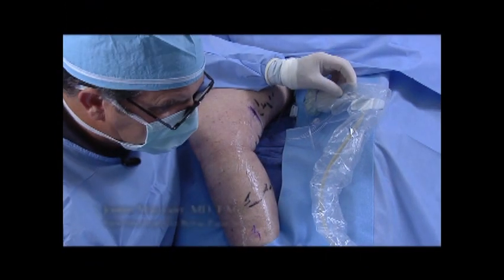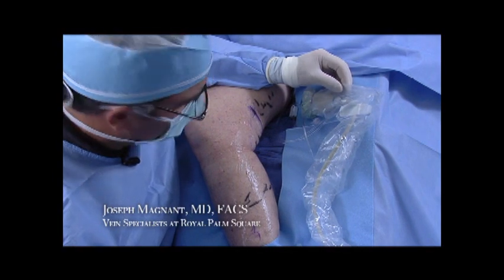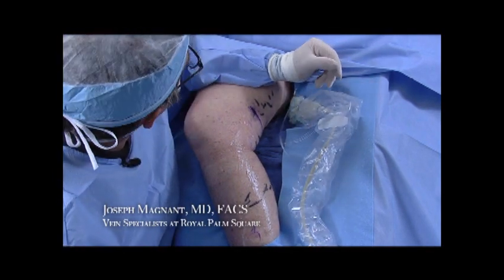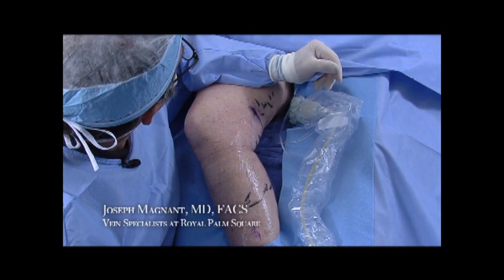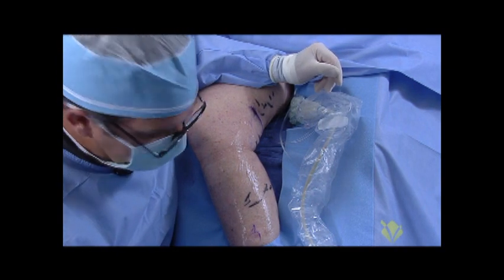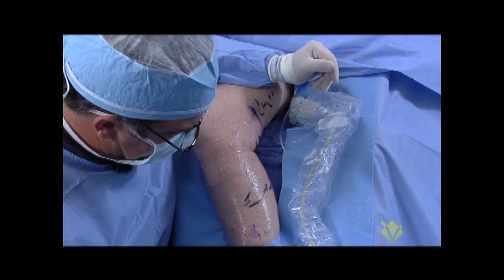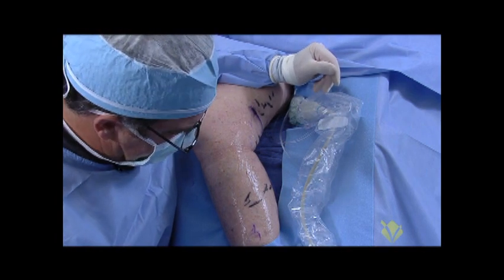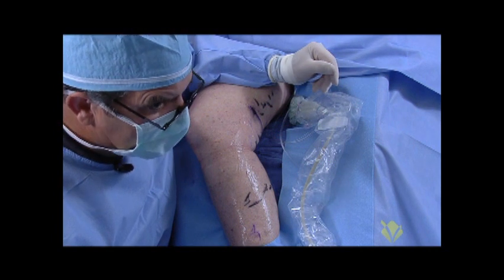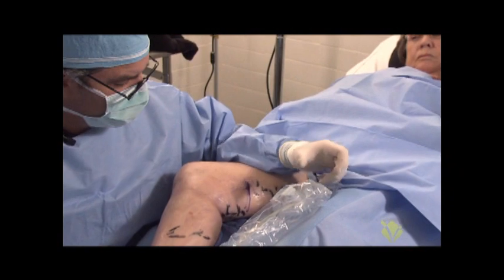What we have here is a 76-year-old female who has had a previous vein stripping, 35 years ago. She presents with recurrent varicosities of the right leg. More importantly, leg cramps and swelling, and her ultrasound evaluation revealed a couple of interesting things.